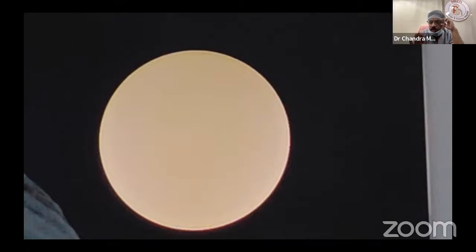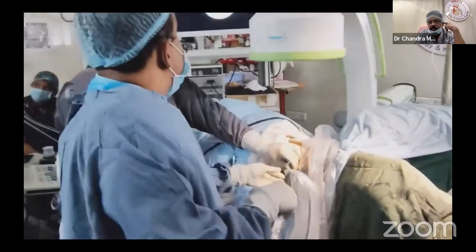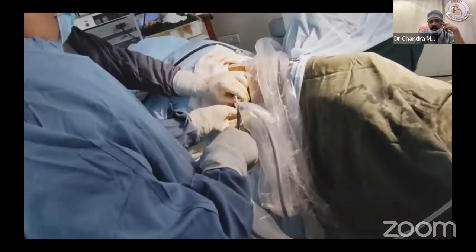Don't pluck out the stone. Don't use laser in impacted stones. Don't use laser in curvatures. It may cause damage. If it is floating, if it is in the pelvis, and all parts of the stone are seen, laser is okay. It should not go inside, it should not come outside.